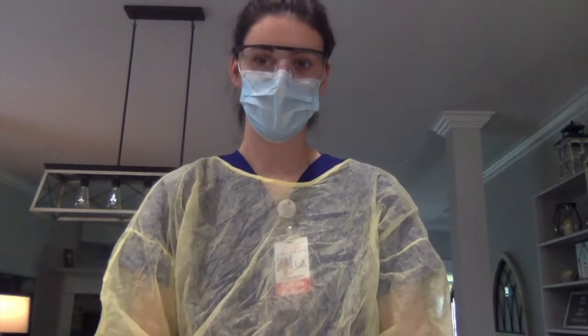So now I'm going to describe my documentation points. I would document the site appearance, the type, amount, color, consistency, and odor of my drainage, the characteristics of my drainage, and if there's any cultures obtained. I would also note the type of cleanser used and the type of dressing I applied, and also how the patient tolerated the procedure. I would also put my date, time, and my signature. And that completes my CVAD checkoff video.